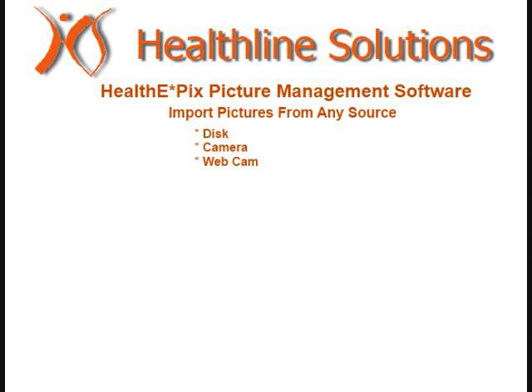Using a webcam is particularly useful in the healthcare environment because it means you never store the pictures for more than a few seconds on any PC, and they are deleted immediately afterward. This eliminates the possibility of the photos being seen by unauthorized individuals. A webcam offers another advantage, the ability to take pictures in a hands-free mode.